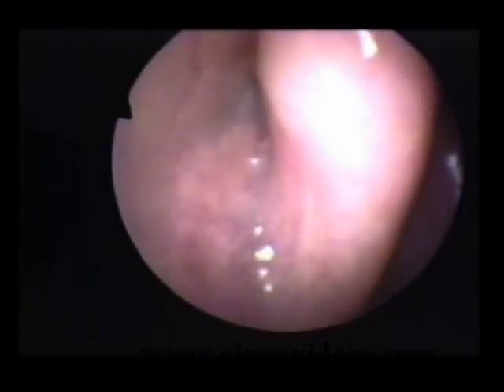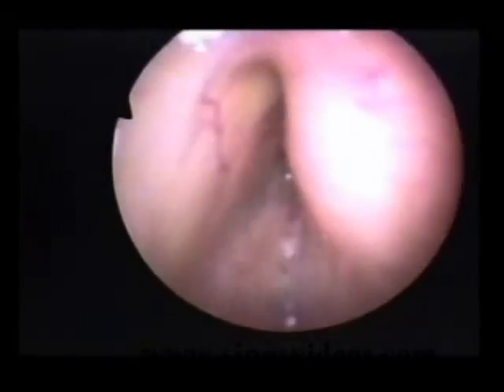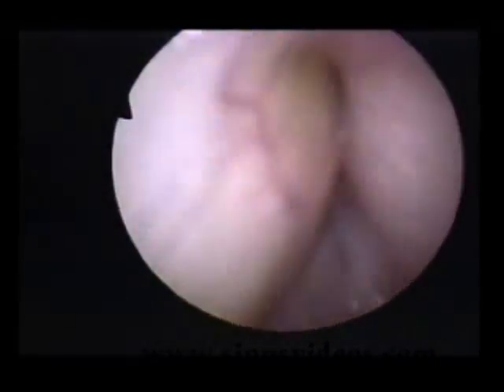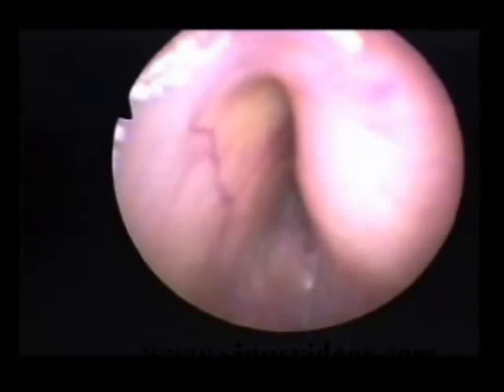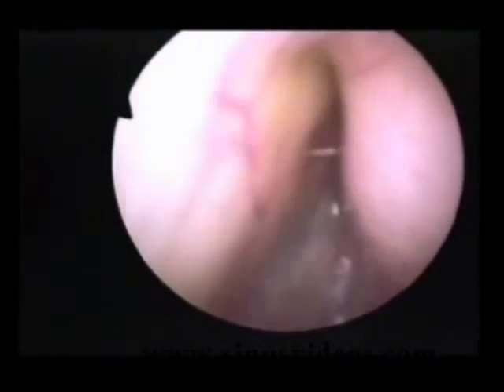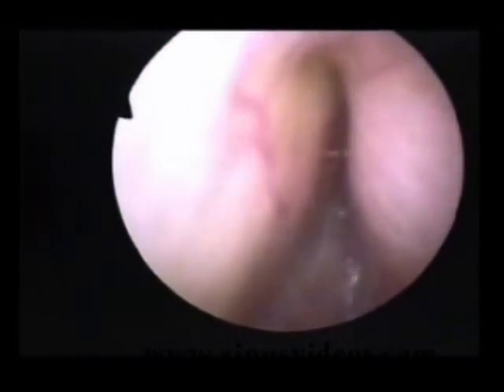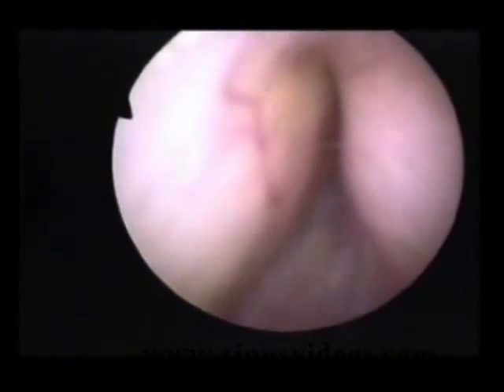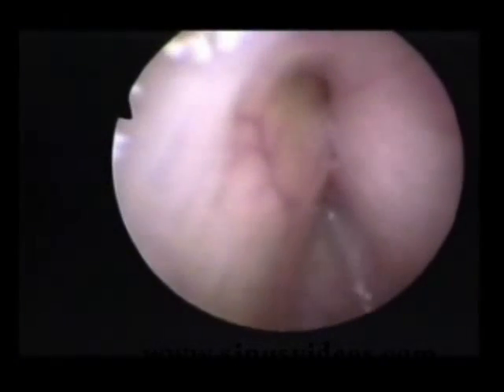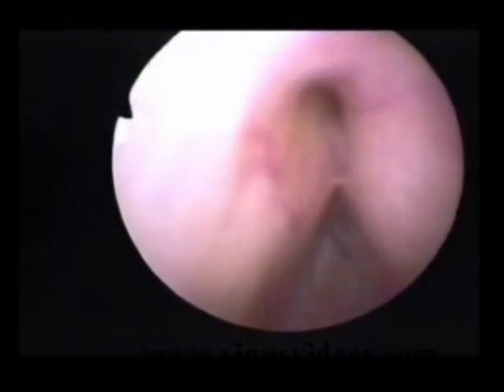This is a right eustachian tube demonstrating hyper-contraction of the tensor veli palatini, seen on the right in the lateral wall. Just at the moment when the tensor should be dilating the eustachian tube, we see tremendous bulking up of the muscle and paradoxical obstruction of the eustachian tube lumen. Here seen in slow motion, there are deep folds in the muscle.